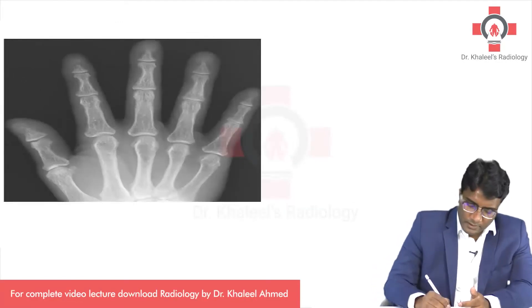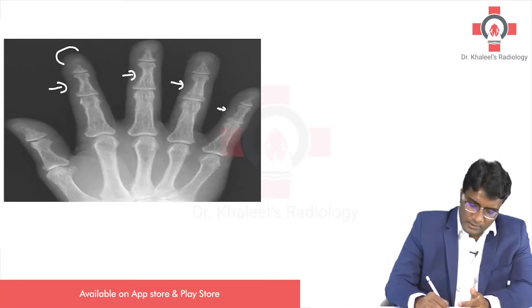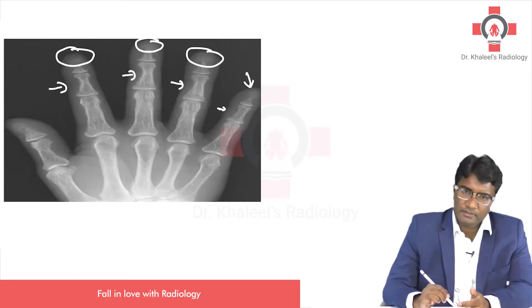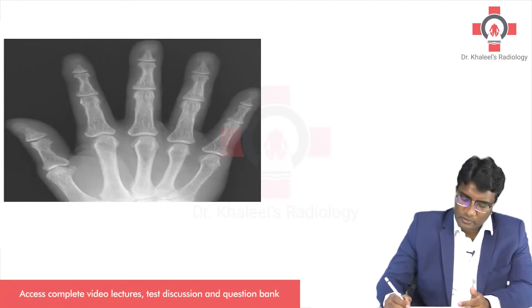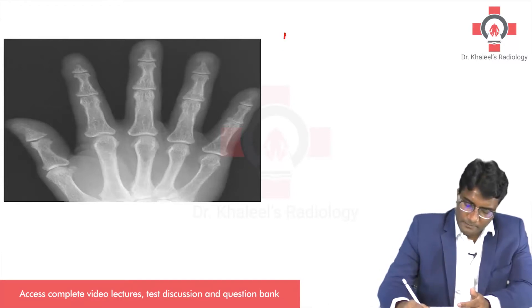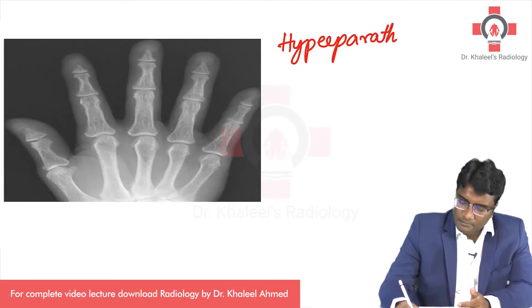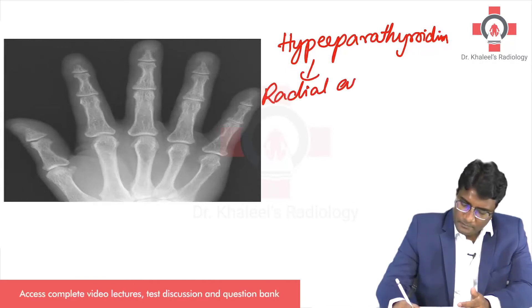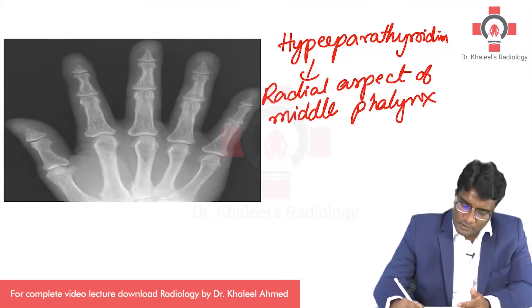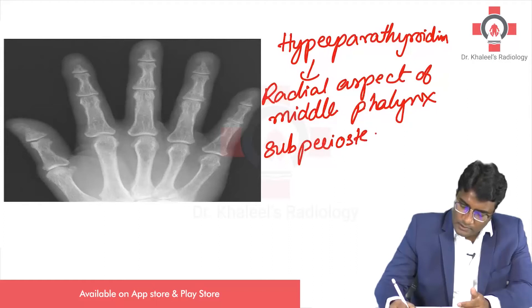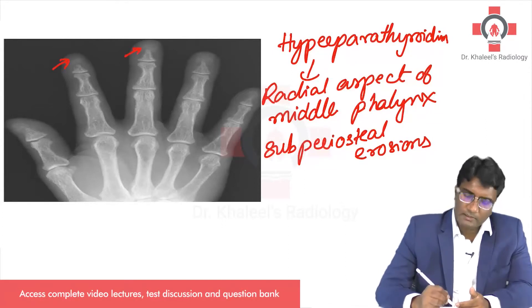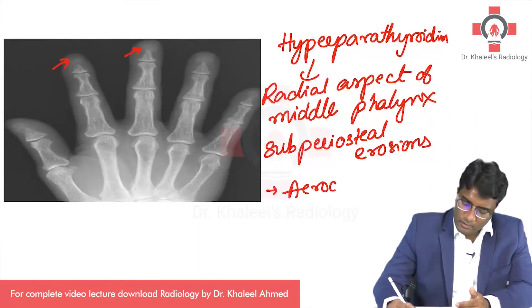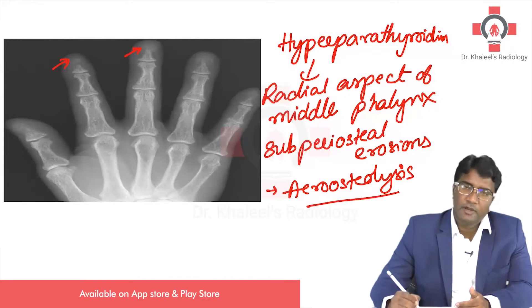When you see these erosions involving the radial end of the middle phalanx, you can also see there is tufting and erosions of the distal phalanx. All of this goes in favour of hyperparathyroidism. Hyperparathyroidism has these classic erosions on the radial aspect of the middle phalanx, and this is because of the subperiosteal erosions that occur in hyperparathyroidism. This destruction of the distal phalanx is called acroosteolysis, also a feature of hyperparathyroidism.